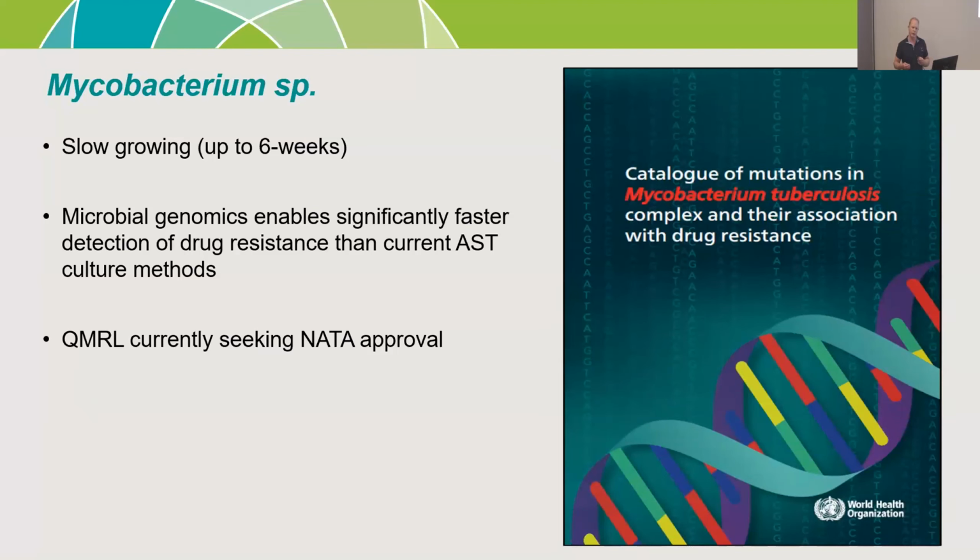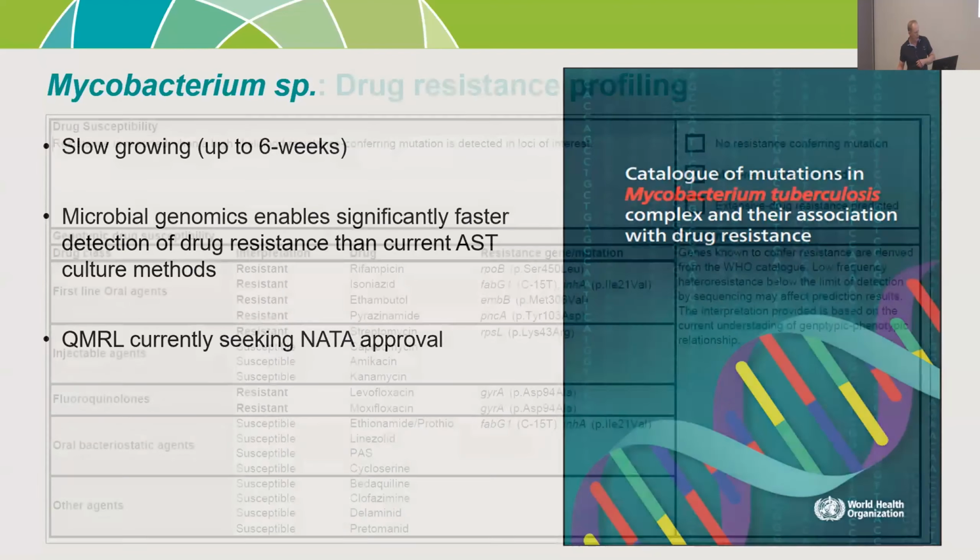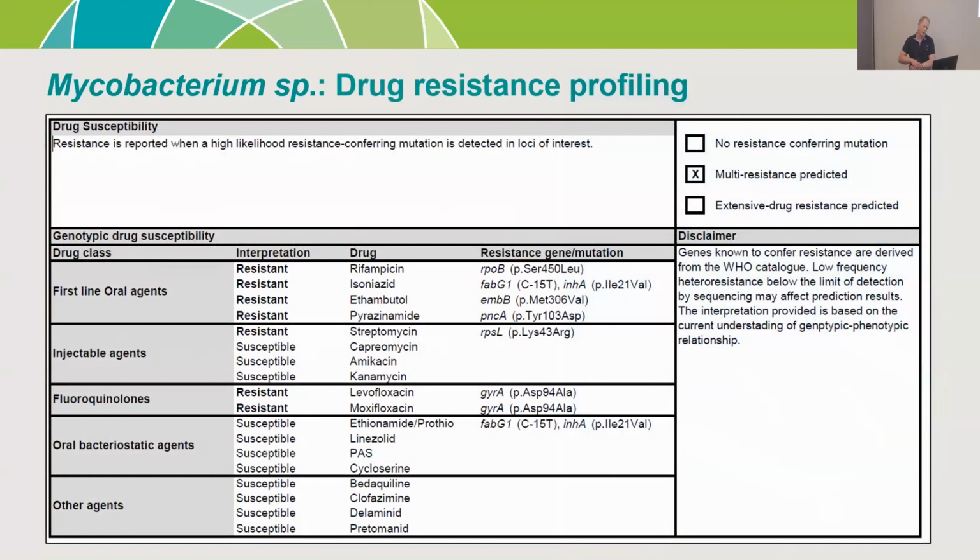So being able to come up with an antimicrobial resistance profile using genomics, from either the initial culture or ultimately, hopefully, from the original clinic sample, is a way of us being able to really respond and treat patients appropriately in the shortest time possible. So certainly we've been working very closely. What we've done is develop all of the processing to generate the raw sequences in tandem with our bacterial isolates that are non-TB. So we're looking at having a combined service so we can maximize the results for the minimum cost.